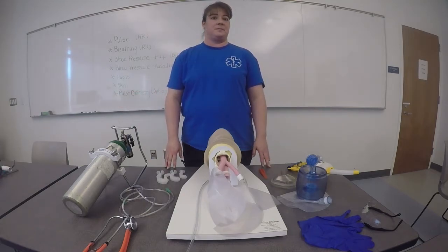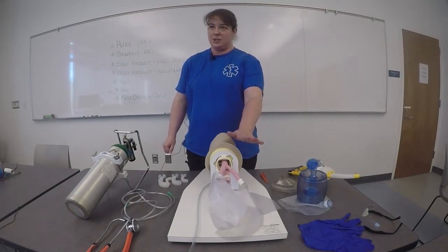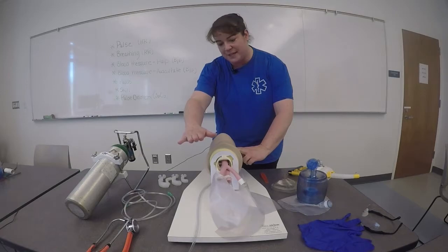Upon your arrival to the scene, you find a patient lying motionless on the floor. Bystanders tell you that the patient suddenly became unresponsive. The scene is safe and no hemorrhage or other immediate problem is found. You have five minutes to complete the skill. My scene is safe and I have taken proper PPE precautions. I'm going to start by checking responsiveness in the patient and there is no response. I'll send someone to get additional assistance and the equipment, and I will check the carotid pulse and breathing for between five and ten seconds. The patient is unresponsive, apneic, and has a weak pulse of 60.